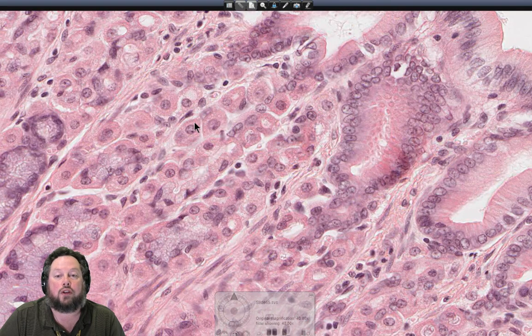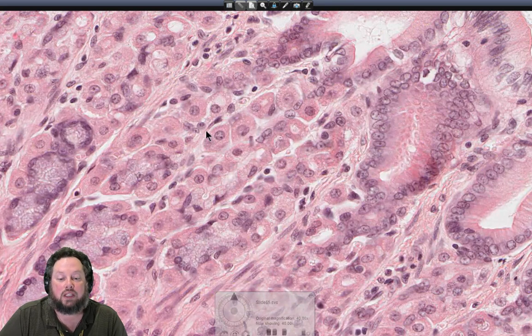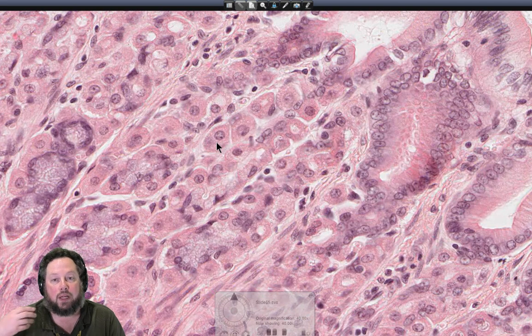These cells are known as parietal cells, and they're responsible for the secretion of hydrogen and chloride ions, which eventually fuse together to form hydrochloric acid in the lumen of the stomach. Now, the reason they're so acidophilic is that they have lots of intramembranous foldings, sort of like intramembranous microvilli almost. They actually use those membranes to have lots of ion channels to pump out lots of hydrogen ions and lots of chloride ions.